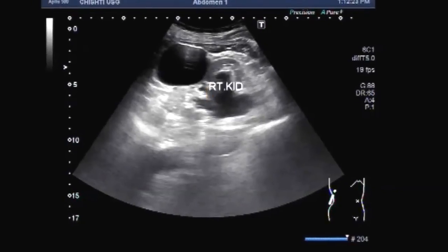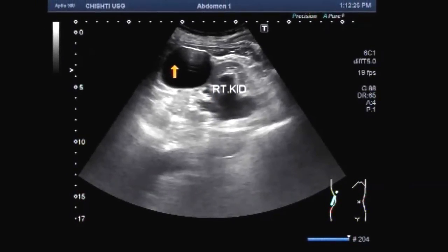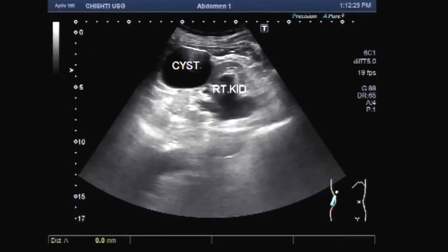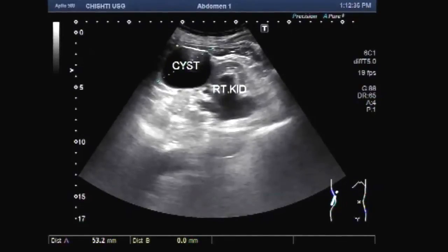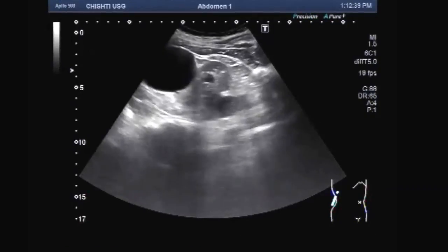This is the right kidney. This is a simple renal cyst attached to the interior wall of the kidney. The cyst measures about 5.3 cm into 4.4 cm.